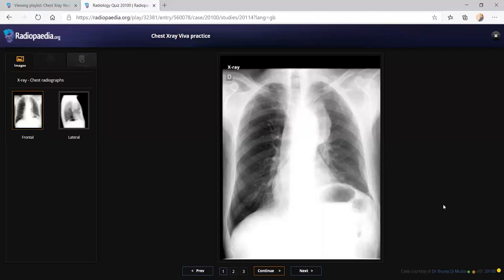So you have to identify and localize the mediastinal lesion in the frontal chest radiograph itself, whether it is anterior or middle or superior or posterior. So here there are very well defined lateral margins and inferior margin, and the superior margin is not clear. When it is going above the clavicle, it is not clear because there is no lung outline in that lesion. So that is not in the posterior mediastinum.